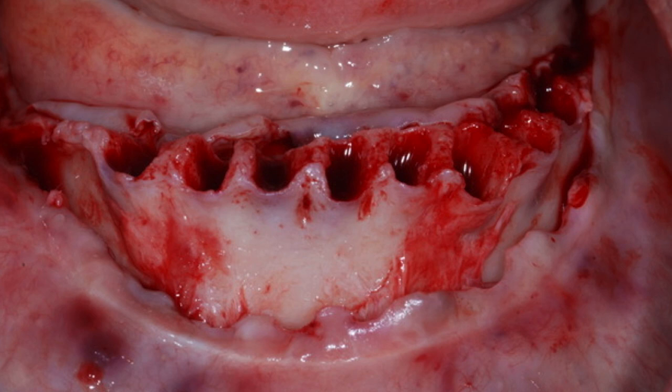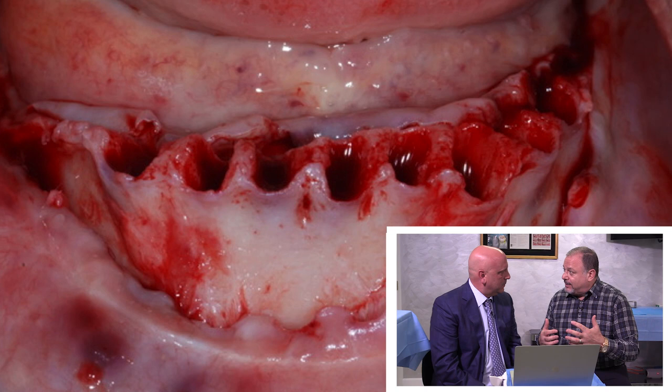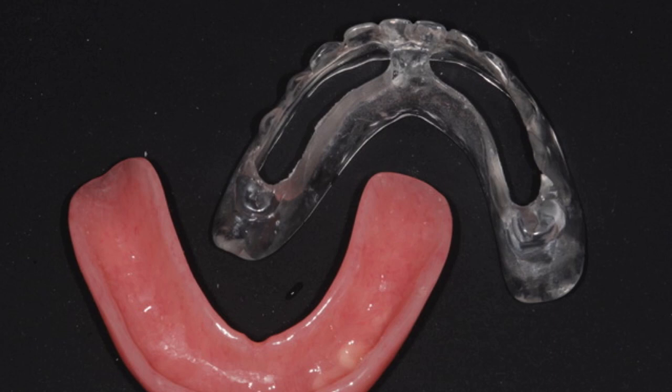So one of the things we do in the beginning with a full arch prosthesis is we have to take some measurements from our CT scan. Generally, from the incisal edge of the prosthesis that we're planning, or natural teeth, there's a reduction of anywhere from 15 to 18 millimeters of space that we need to reduce the bone. So here we're looking at our crestal incision, teeth are removed, and we have our prosthesis made from our lab, which is going to be our full denture.